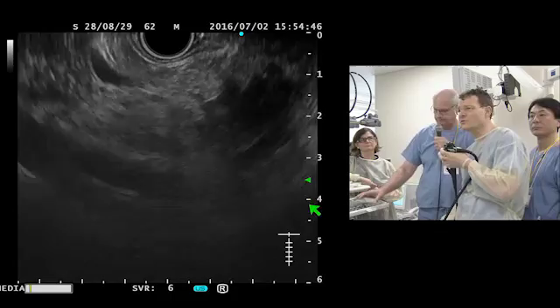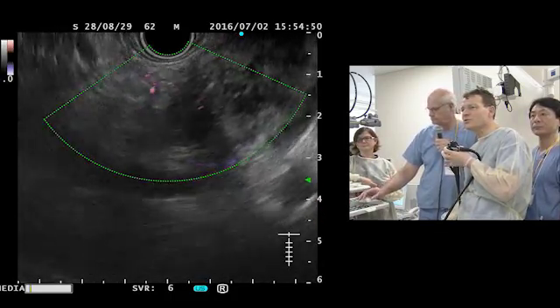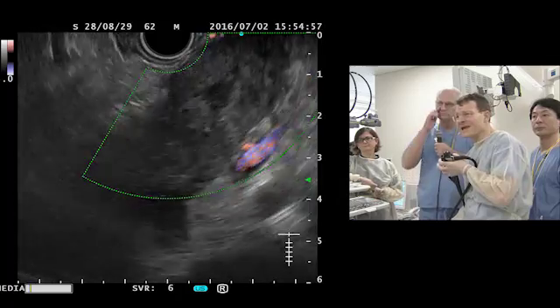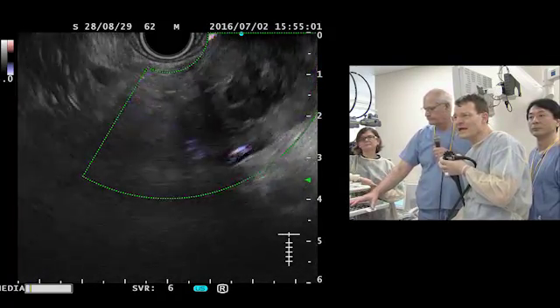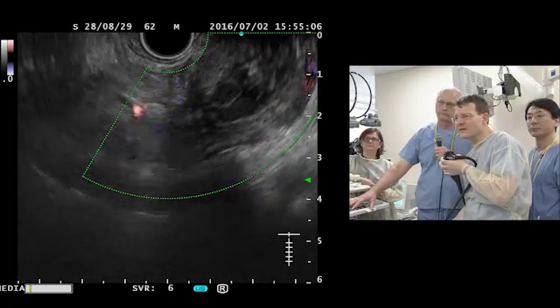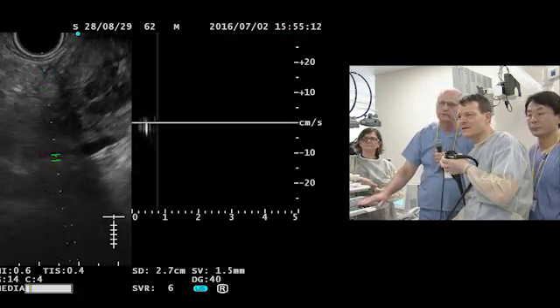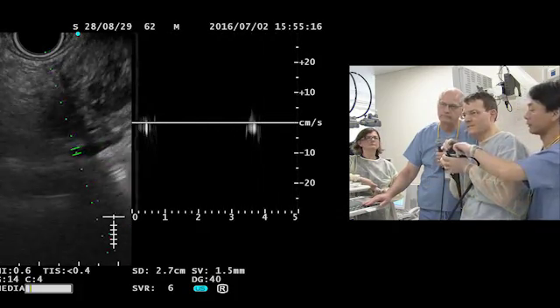And now we will focus on the vasculature. Now we will focus on the vessels. In this area, we expect two kinds of vessels. It is the splenic vein and the splenic artery. And I think when we watch here at this vessel, I think this is the artery, but there is no more interface. So we can use, I think, pulse wave if you want. Sometimes take picture. Okay.